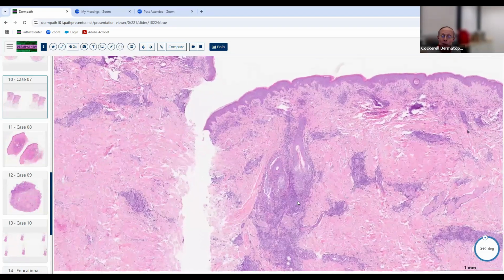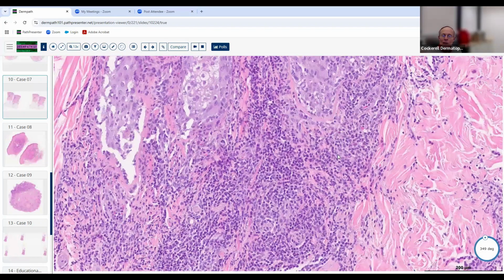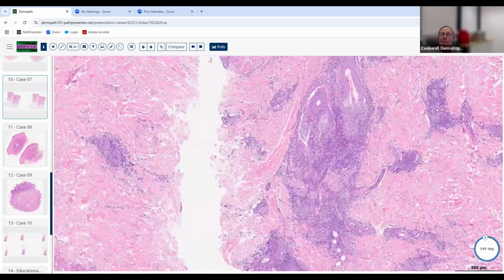Do we see plasma cells associated with the lymphocytes? If we see that, that tends to favor Lyme disease, and again, another L, differential diagnosis. We don't really see too many of those, so we probably wouldn't think of erythema chronicum migrans here either.